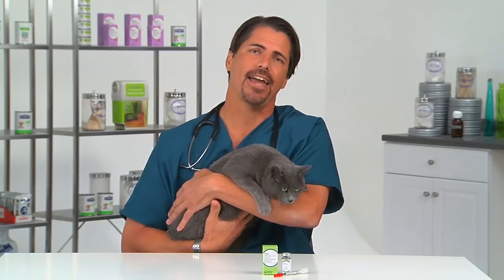Hello, I'm Dr. Mike. Today we're going to learn how to prepare an insulin syringe to inject your diabetic cat. We'll visit Lisa, who has a diabetic cat on insulin, to watch her prepare the syringe.